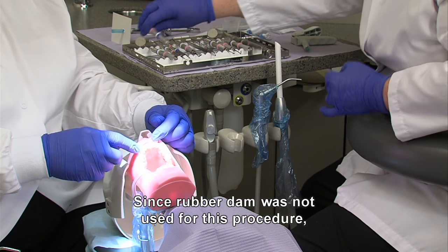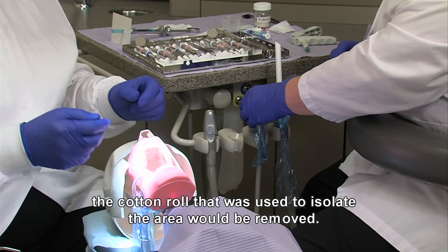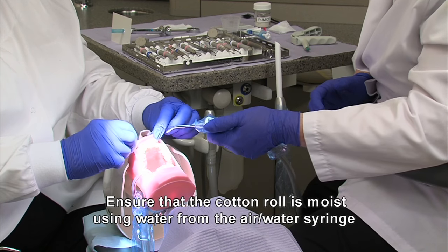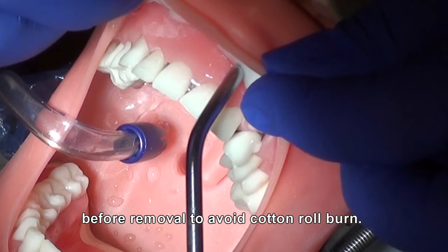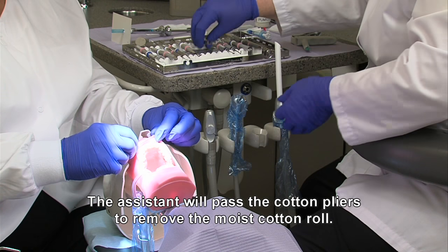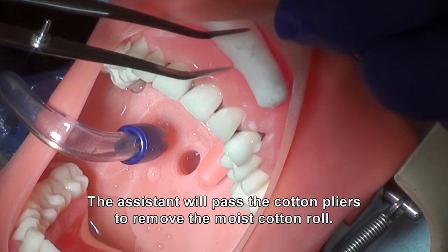Since rubber dam was not used for this procedure, the cotton roll that was used to isolate the area would be removed. Ensure that the cotton roll is moist using water from the air-water syringe before removal to avoid any cotton roll burn. The assistant will pass the cotton pliers to remove the moistened cotton roll.